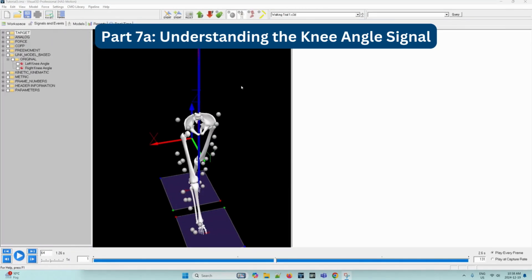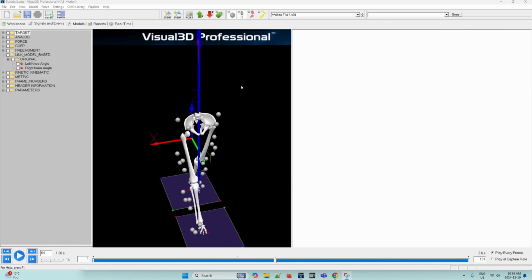Next, we can use the application to understand this knee angle signal that we have created. To do this, we can graph the X component of the right knee angle and left knee angle signals. So first, right click the left knee angle signal within the link model based folder. And select Graph X and New Graph. So we can navigate to the left knee angle signal here. Right click it. Select Graph X. And then New Graph.